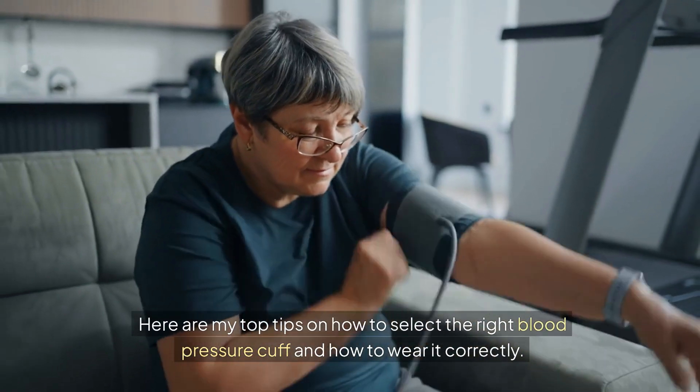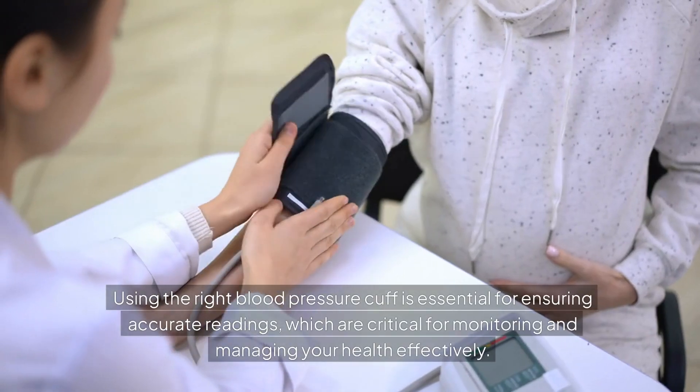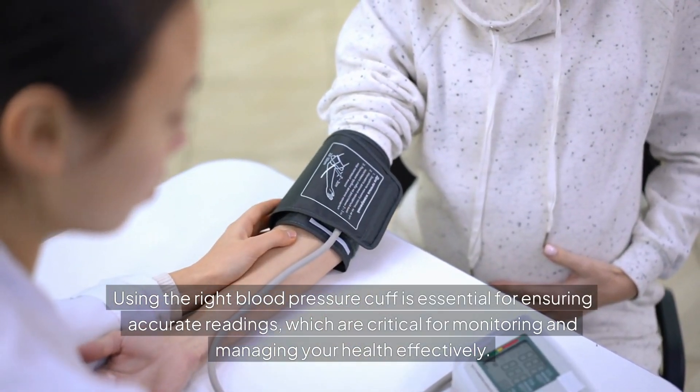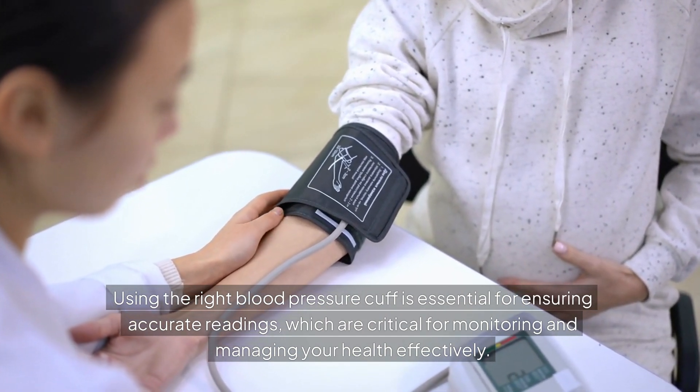Here are my top tips on how to select the right blood pressure cuff and how to wear it correctly. Using the right blood pressure cuff is essential for ensuring accurate readings, which are critical for monitoring and managing your health effectively.